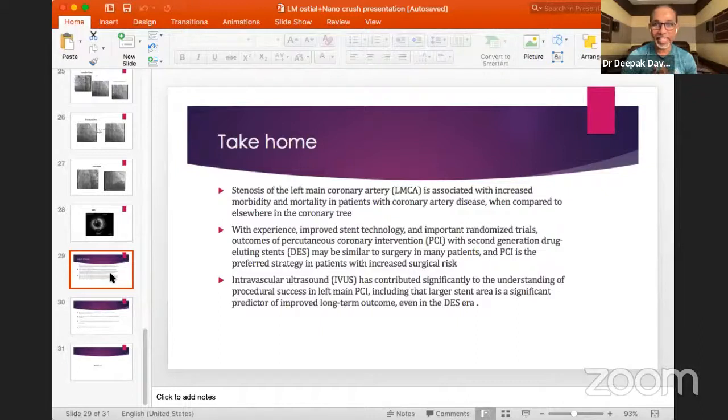And for a bifurcation lesion, you need to have a lot of push and pull. You started off with an EBU catheter through the femoral approach. So for every beginner, that's a great learning point. Start off with an EBU catheter when it's an ostial lesion and a bifurcation, you need to have good backup support. The second most important point that I had in mind is you wanted to keep it simple in the first case as well as the second case.